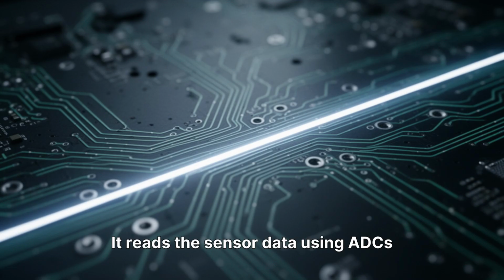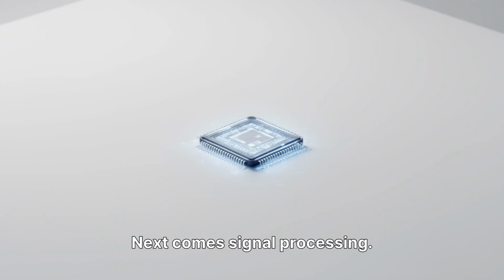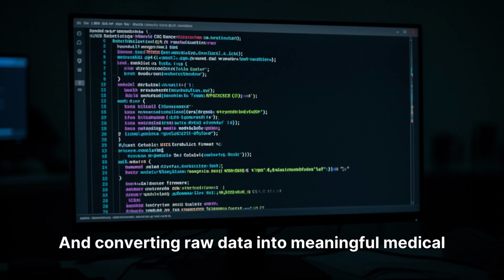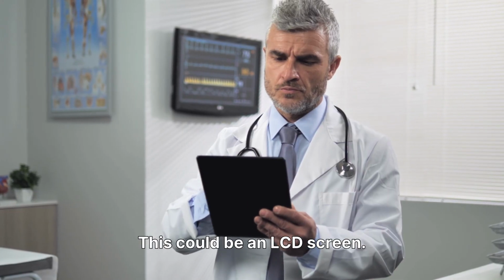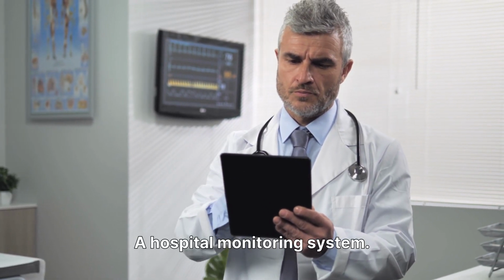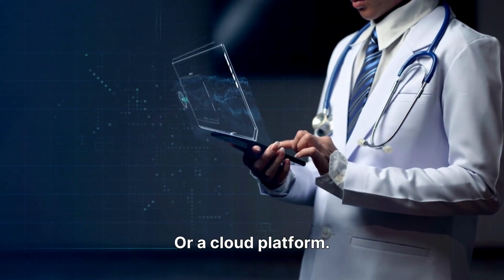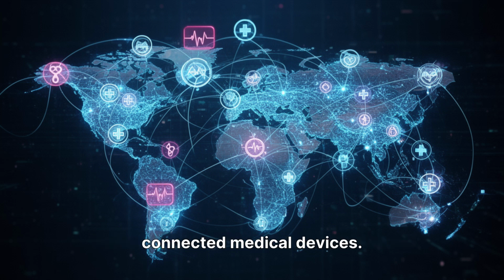It reads the sensor data using ADCs or digital interfaces. Next comes signal processing, filtering noise, amplifying signals, running algorithms, and converting into meaningful medical measurements. Finally, the results go to display or connectivity systems. This could be an LCD screen, a hospital monitoring system, a mobile application, or a cloud platform. This architecture is used in many modern connected medical devices.